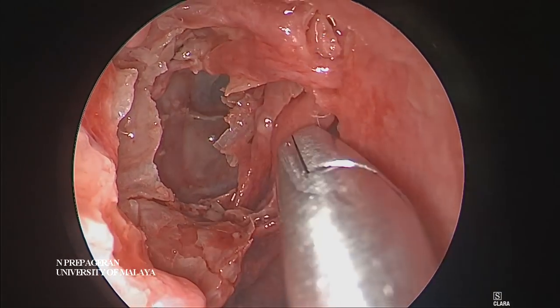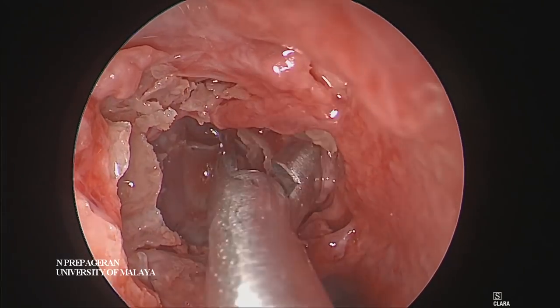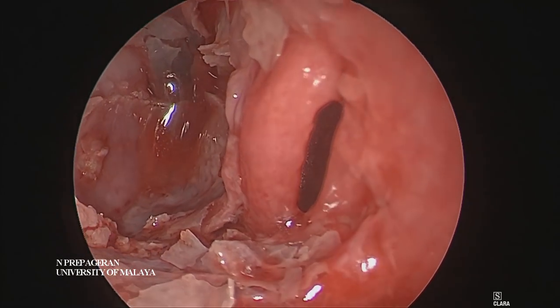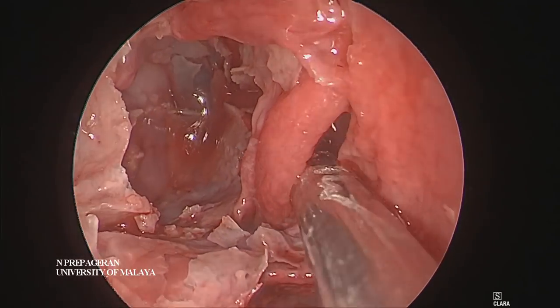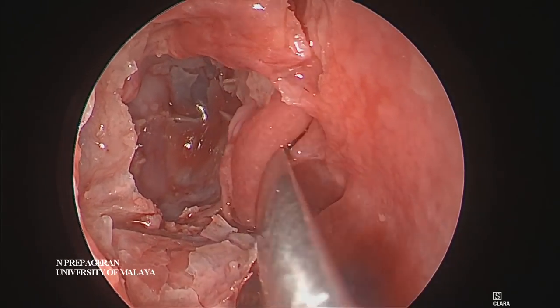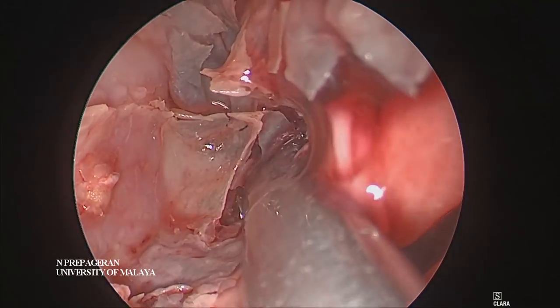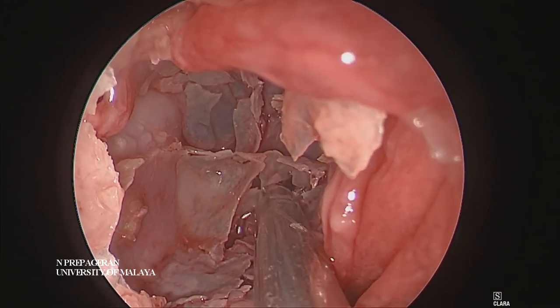So if you are worried about entering the sphenoid sinus and not sure whether you are in the right plane or not, what I suggest is: always find the superior turbinate. So with the superior turbinate as your reference, you can actually see the anterior wall. That is the anterior wall of the sphenoid sinus. You can see the superior turbinate — if we displace it, we are already looking at the sphenoid mucosa. And that's where the sphenoid sinus would be. Always go medial and inferior and you will enter the sphenoid sinus.